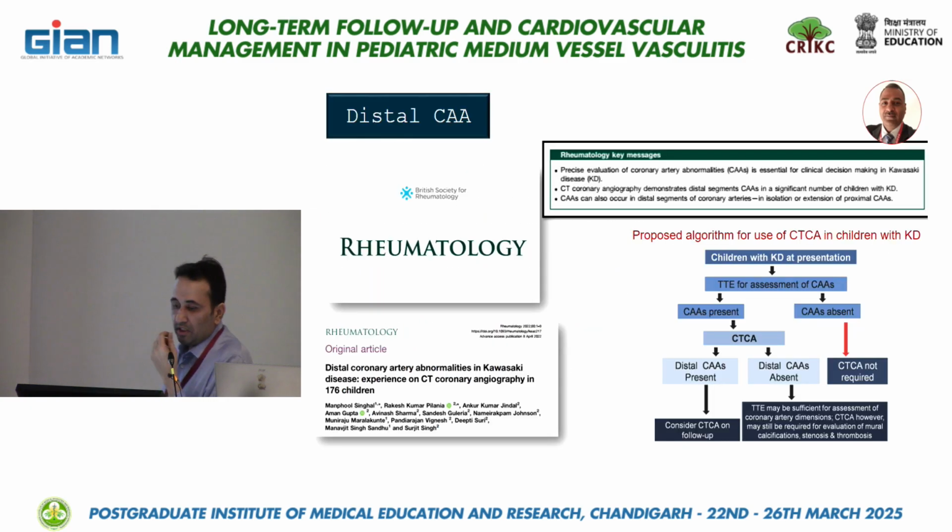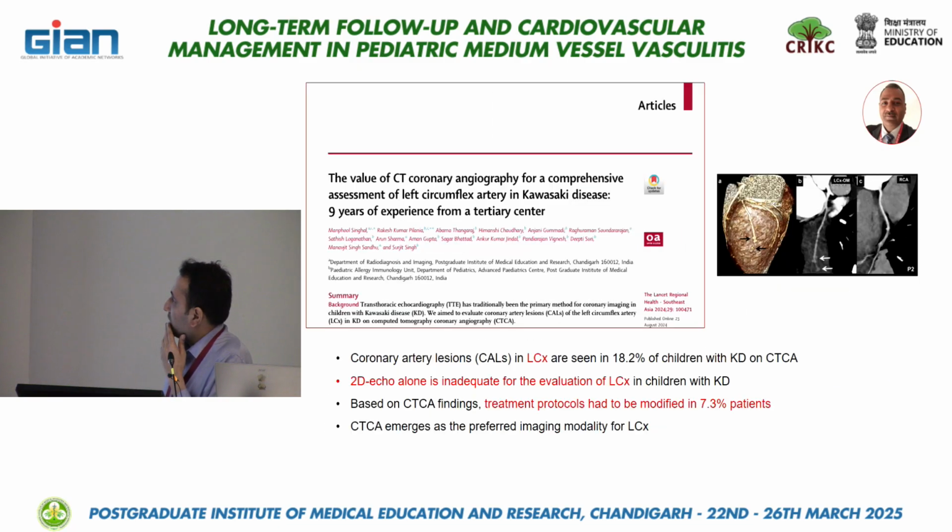This paper has already been shown by Supreet, in a proposed algorithm of distal CTCA as per the requirement. And why we require CT coronary angiography is also because the left circumflex is hardly visible. We had a 1 hour hands-on session today, and everybody was convinced that it's difficult to see the LCX, for several reasons. So 2D echo is inadequate in identifying the LCX.